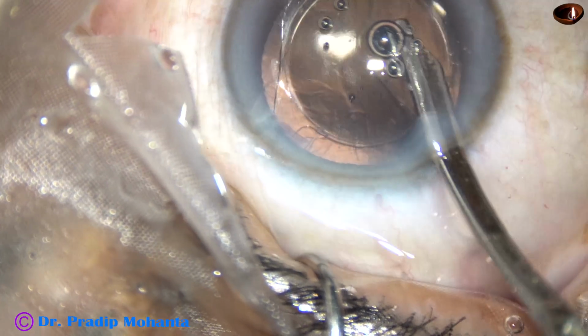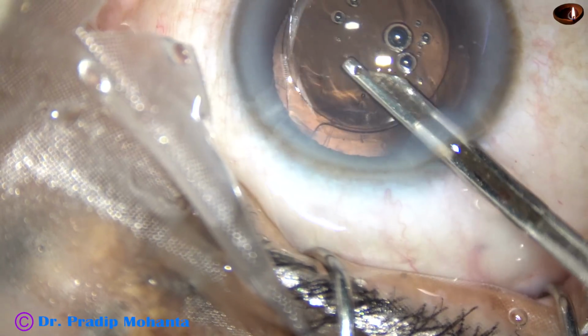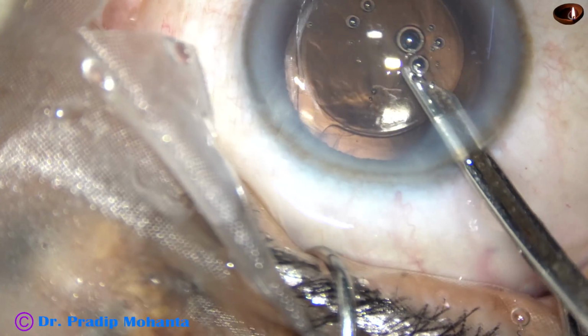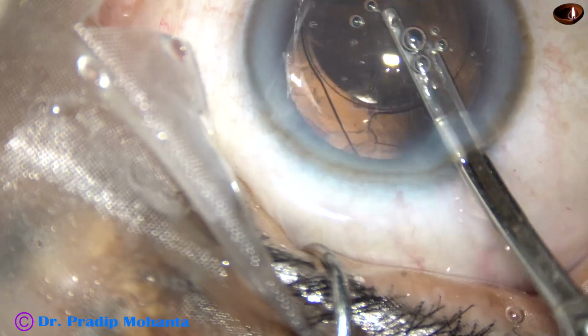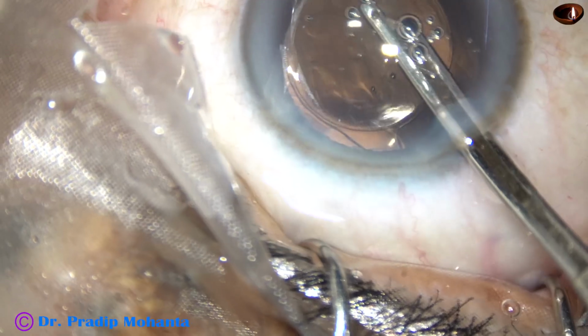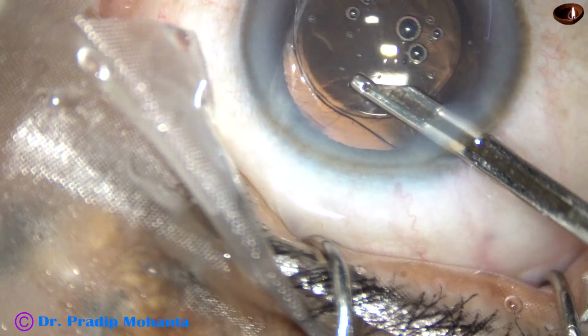Cortex is nicely cleaned, and now I'm going to remove the visco from the anterior chamber as well as from behind the IOL. The bolus of viscoat will come easily. We're going to see that in a moment.